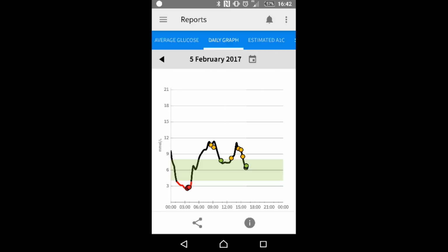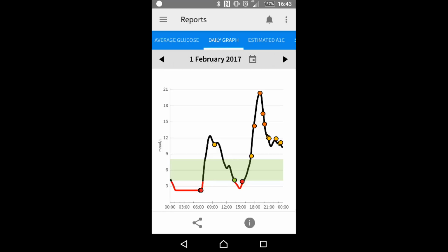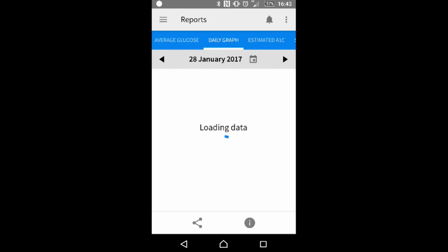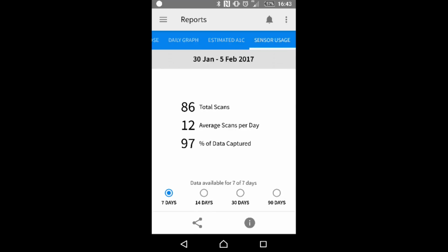You've got your daily graph, which you can flick through, and you can see how you've got on. Some of these results are pretty terrible, but it's something I can work on, and hopefully it'll be a little bit better. You've got your estimated HbA1c on the next screen, so mine's 6.9. Hopefully the diabetes nurse won't moan too much about that one. This has to gather plenty of information from the sensor in order to work. So it won't work for the first few days, but after a week or so this comes up and gives you your reading.